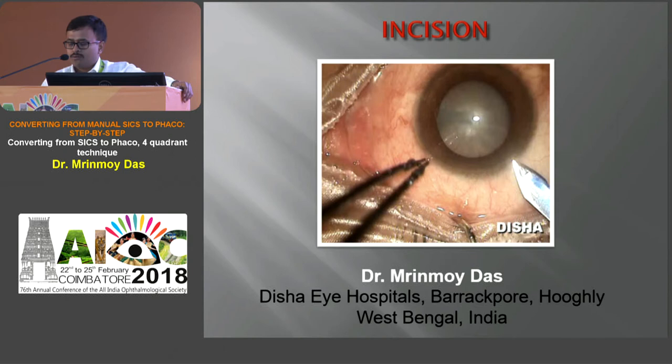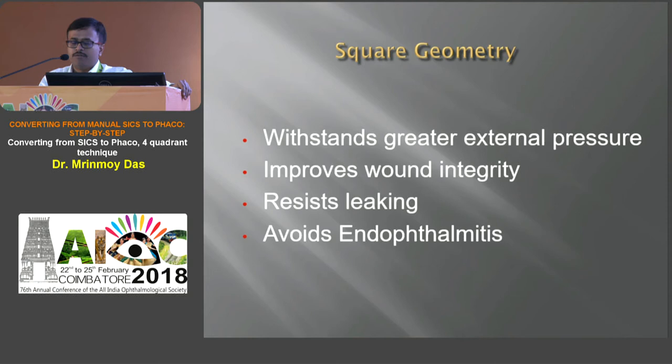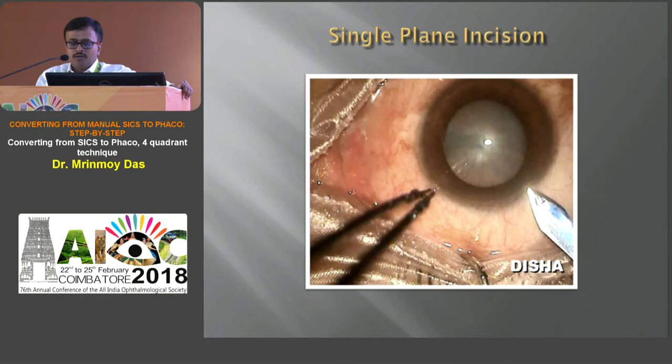The incision should be of square geometry because a square geometric shape withstands greater external pressure, improves wound integrity, resists leaking, and thus prevents endophthalmitis. For the beginner, the incision may be superior or temporal, but superior is preferred because whatever surgery he has done previously, he has done through the head end — so the superior incision will be familiar. This video demonstrates how to make a single-plane incision: you just enter into the AC directly with a 2.8 keratome.